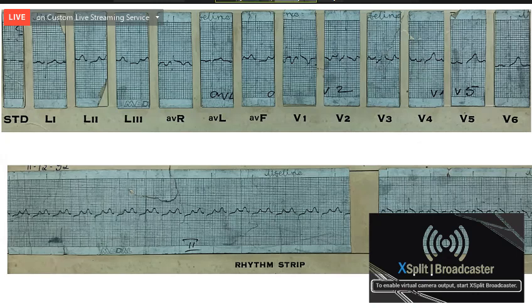When this combination comes, why did you diagnose left atrial enlargement in this patient? The terminal portion of the P wave is more than 1 millimeter in depth in V1. Okay, 1 millimeter in depth is not enough, actually. What is the definition of left atrial overload or left atrial enlargement in the P wave in V1? More than 0.04 millimeter second. No, 0.003. Okay, more than 0.003 millivolt seconds. Not millimeter, millivolt seconds.